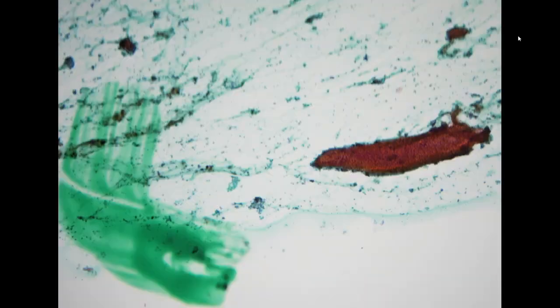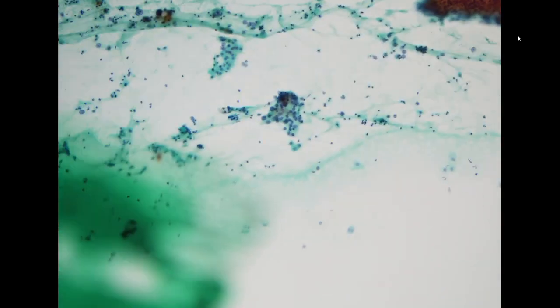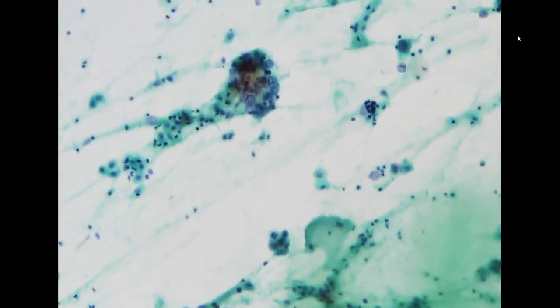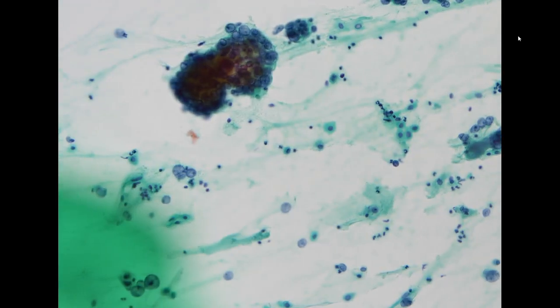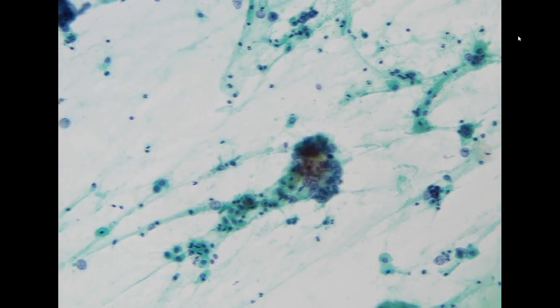And it is everywhere. Everywhere means that it is invasive. So we already see highly atypical tumor cells, and it's everywhere. It's invasive, and in the background it does show a tumor diathesis pattern, which means that this is a direct sample. So the lesion is in the cervix. That's why you can see it's everywhere. Okay, so this is compatible with tumor in the cervix.